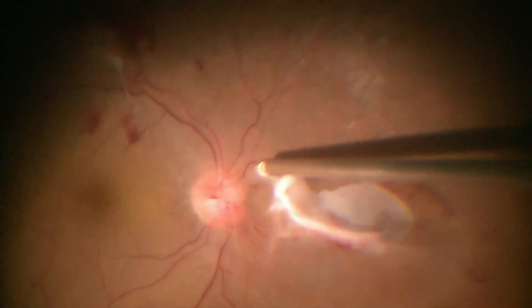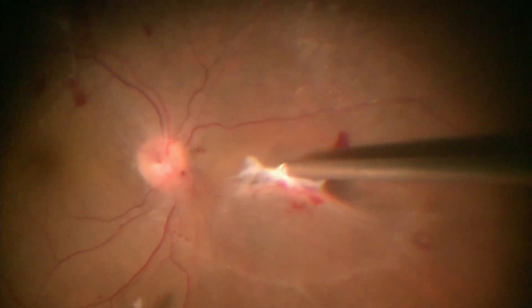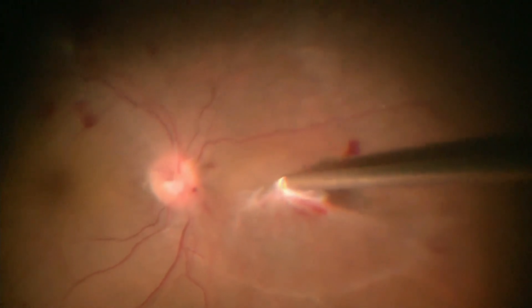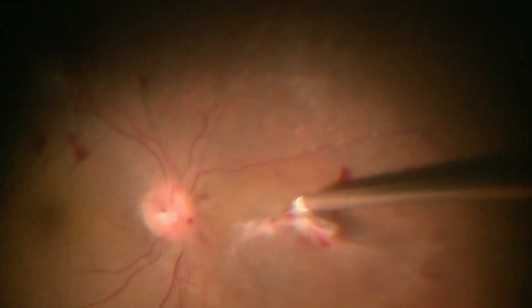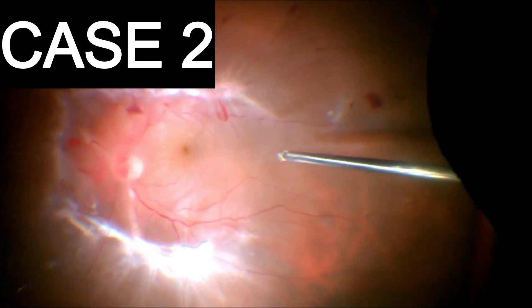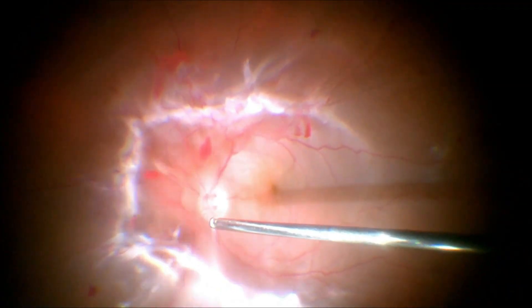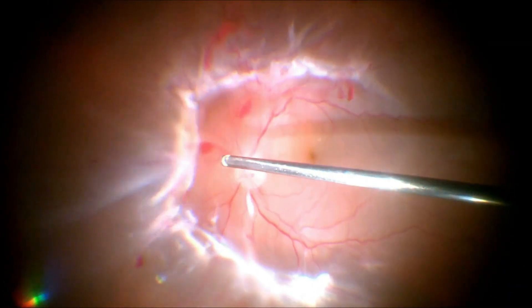All the residual stumps are cleared. In yet another case of tractional retinal detachment, we realize that the fibrovascular adhesions are quite strong and widespread along the arcades.